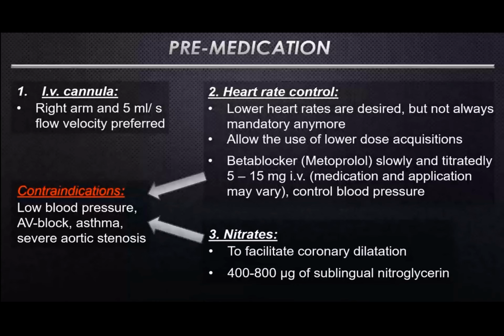Then this brings us to the second part, heart rate control. Lower heart rates are always desired, not necessarily mandatory anymore. However, a lower heart rate allows you to use really low dose acquisition because your scanning time gets shorter and the pulsing window also gets shorter. That means the length of maximum dose is shorter when you have lower heart rates.